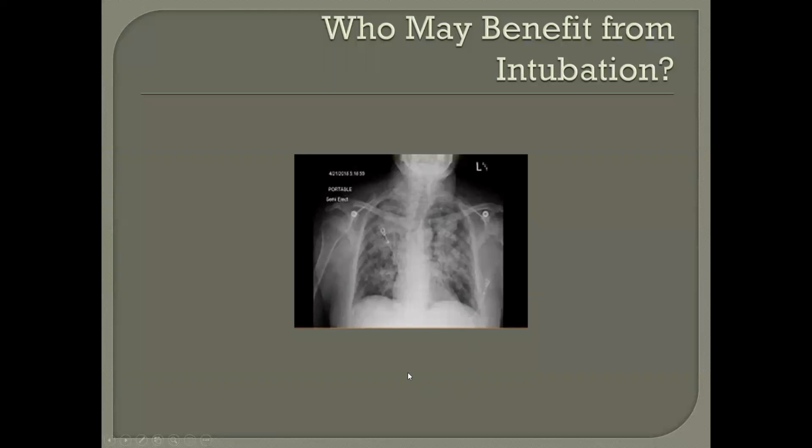It's one of the things I covered at our intubation station for competency day: how do you judge a difficult intubation? One of our roles with the physician is doing just that, getting a Mallampati score if you have that luxury. If it's an elective intubation, looking at a chest X-ray that includes the neck, which many times it does. Also, if there are any notes from an anesthesiologist or a respiratory therapist that say it was a difficult intubation.